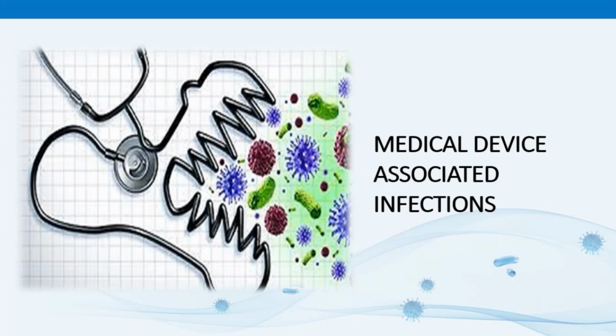Modern healthcare uses many types of invasive devices and procedures to treat patients and help them get better. Unfortunately, infections are sometimes a result of this treatment, caused by insertion of devices like catheters, ventilators, or having an invasive procedure. Each of these procedures involves contact by a medical device or a surgical instrument with a patient's sterile tissue or mucous membranes. A major risk from all these procedures is the introduction of pathogenic microbes from failure to properly disinfect or sterilize devices. Inadequate reprocessing can lead to device-associated infections, tissue irritation, and other adverse patient outcomes. Now, the actual number of infections that can be attributed to inadequate device reprocessing is unknown because it's not often investigated as a cause.